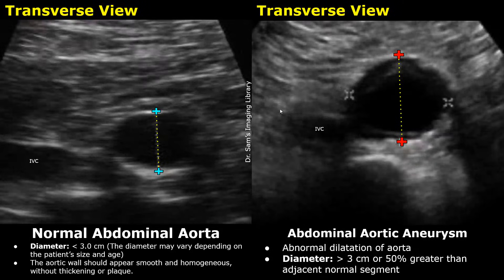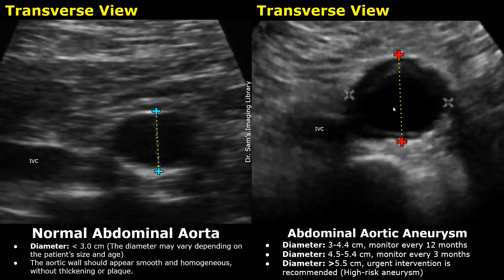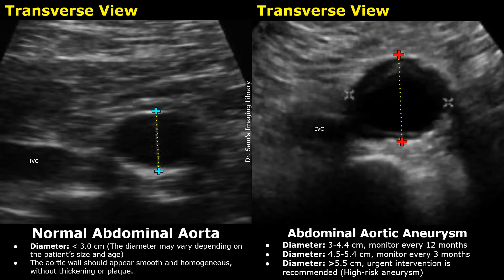This is a transverse image showing an aortic aneurysm with a diameter greater than 3 cm. Many aortic aneurysms are seen incidentally on ultrasound and are asymptomatic. Small aneurysms have a diameter between 3 and 4.4 cm and require monitoring every 12 months. A medium aneurysm is between 4.5 and 5.4 cm, requiring monitoring every 3 months. A large, high-risk aneurysm has a diameter greater than 5.5 cm, with a very high risk of rupture, so immediate intervention is required.